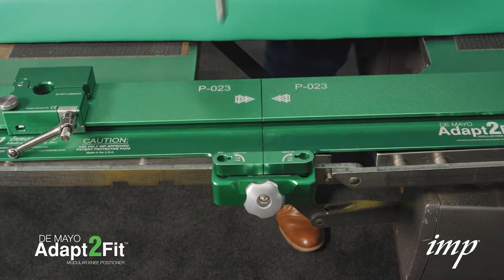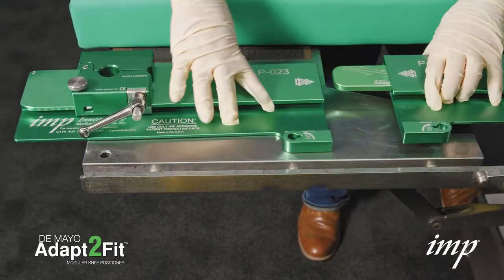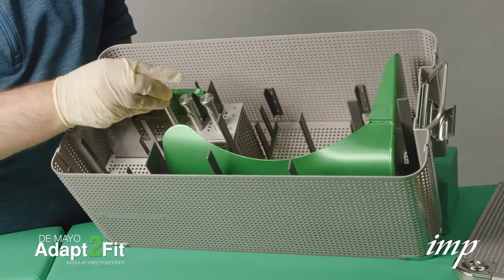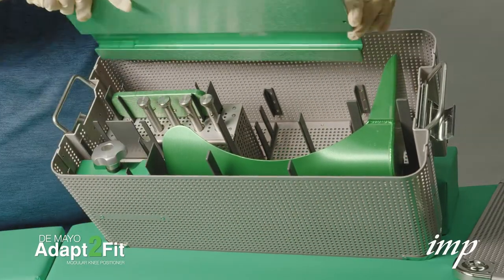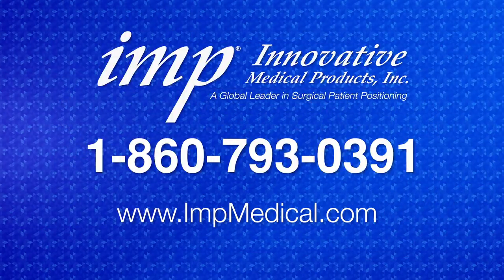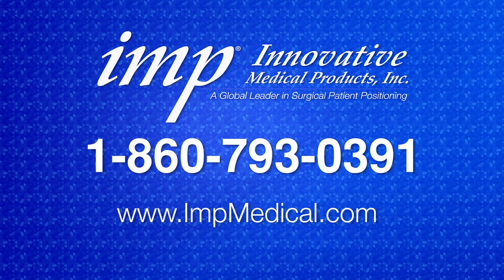After surgery, it is recommended to spray the positioner with a pretreatment prior to re-sterilization. That concludes the De Mayo Adapt2Fit Modular Knee Positioner in-service video. If you would like more information, someone to contact you, or a trial of the De Mayo Adapt2Fit Modular Knee Positioner, please contact IMP using the information provided on this screen.